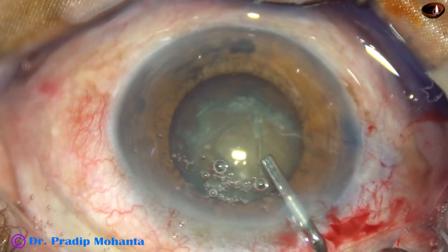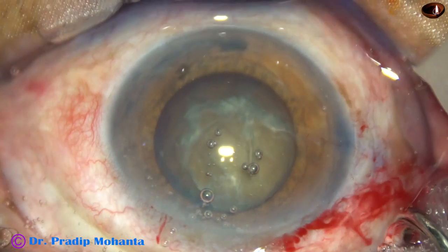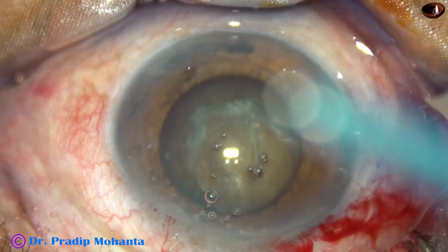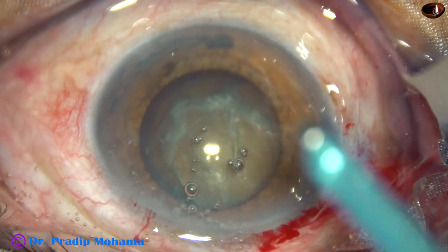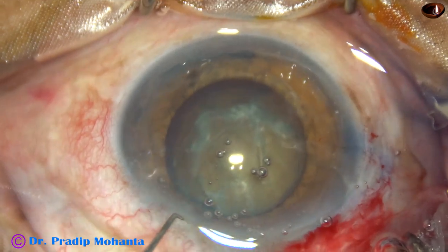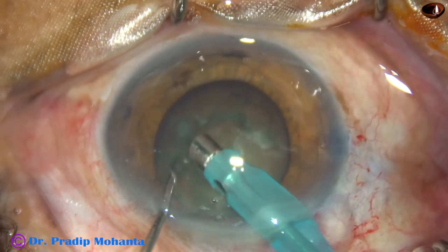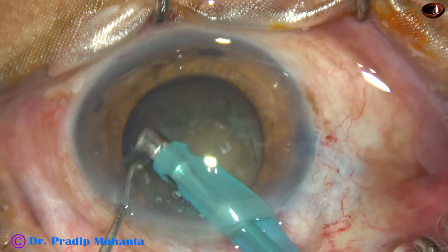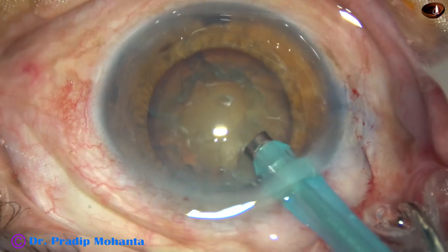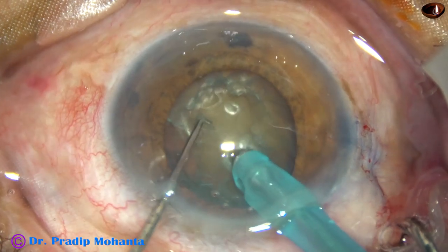Some more visco, 2% HPMC. And then the tip of the phaco needle is introduced into the anterior chamber, bevel down. The chopper fixes the eyeball. The phaco needle goes in. Some superficial cortical lens matter is aspirated. Handpiece is turned.